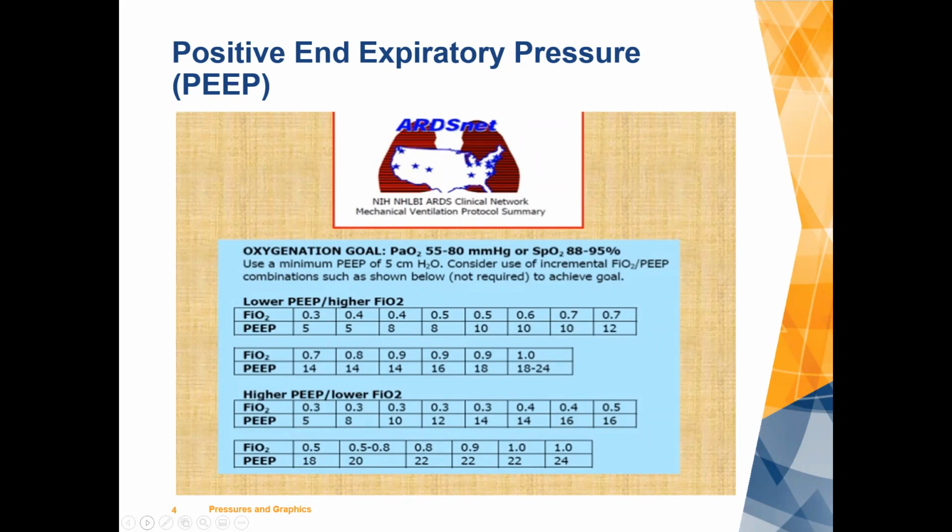It's really like a protocol. We just go with 8 for all kinds of reasons. It was a first step in not being so arbitrary in setting all these patients on 5 of PEEP. Some of these patients really look like they could benefit, just in terms of their x-rays, their oxygenation, and the guidance we get from ARDSNet for starting them up on higher PEEP. The other thing is that we found that some of the patients, particularly ones coming from the OR and the recovery room, were also de-recruited, that they were on anesthesia machines and they had inadequate PEEP. So we actually found some benefit there.